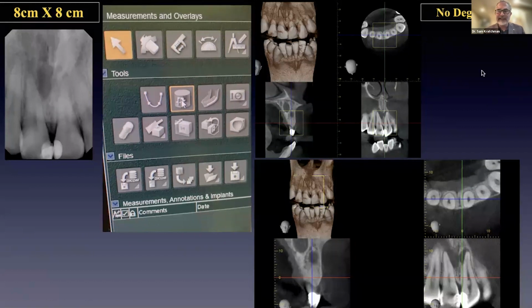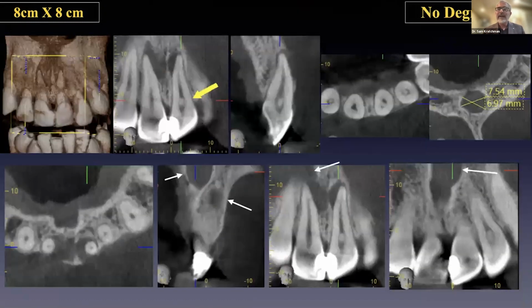And then very easily, I'm just going to go, and I'm not a computer whiz, so whatever I show you is just stuff that is fairly easy to do. Basically, you box the area that you want to look at and then double click, and this is the imaging. So it's blowing it up for me without distorting the images.